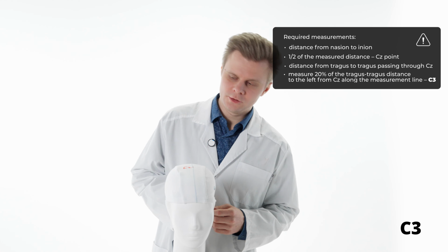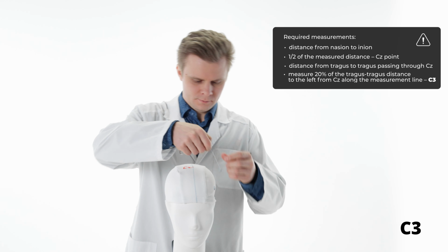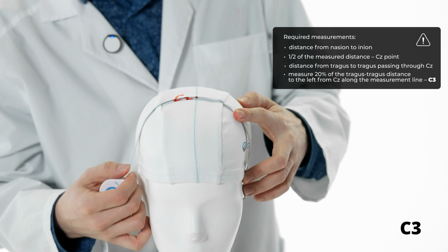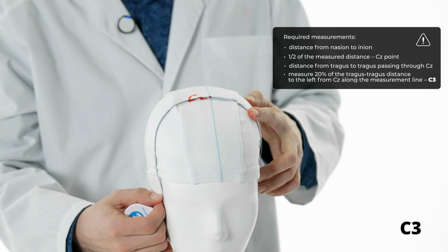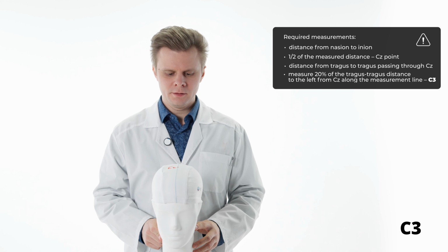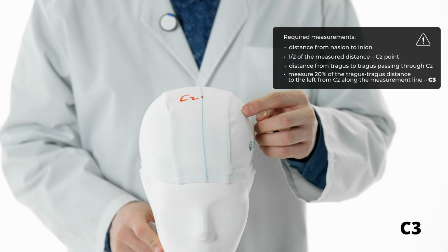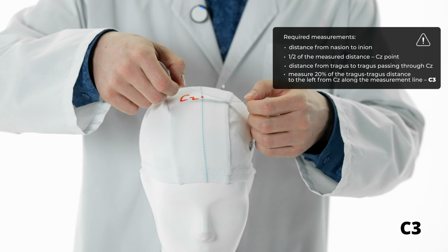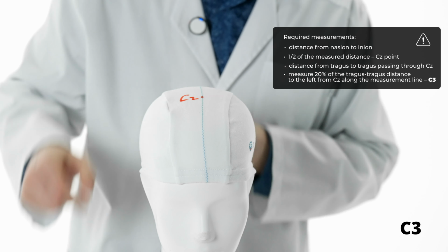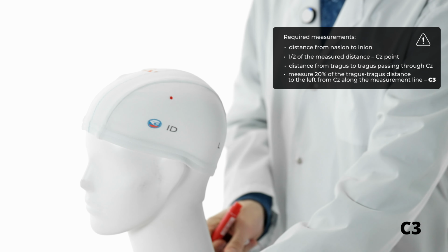Then, make circumferential measurement in coronal plane between periauricular points through CZ point. This distance equals 34 centimeters. C3 point lies 20% left along this line from CZ point, or in our case, 6.8 centimeters. Mark C3 point.